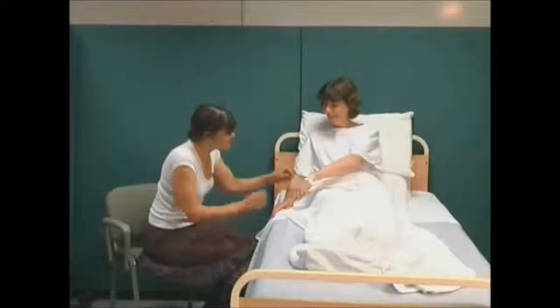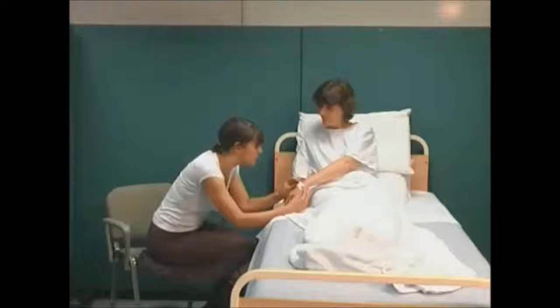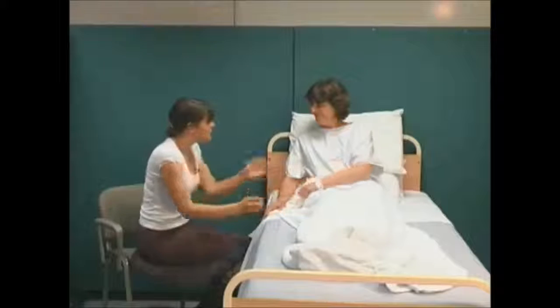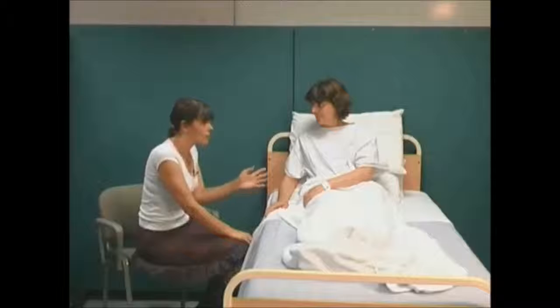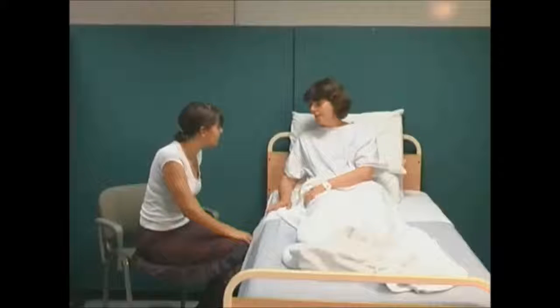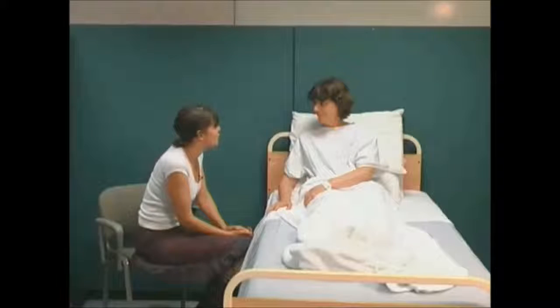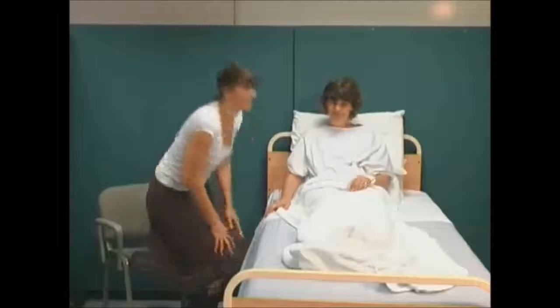Can I just check your wristband? Okay. So you're Alice Winter, 10th of December 1980, hospital number 123456, and that is you? It is. Okay. Do you have a preference of which arm I use at all? No, not at all. And there's no reason why I can't use one or the other arm? No, there's nothing that I know of. Okay. I'll go prepare my equipment and then I'll come back and we'll pop a cannula in so that you can receive your IV antibiotics. Okay, thank you. See you shortly.